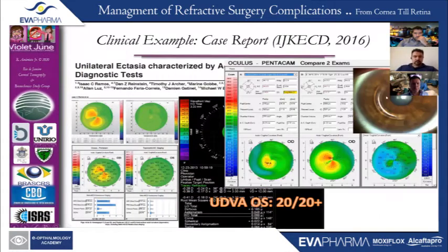This patient has a ring in the right eye with an excellent result, probably the best results that you can get, and that's because the cornea is not abnormal in terms of the structure. It has a warp because of the eye rubbing that the patient admits to have, but the fellow eye is very, very much normal.